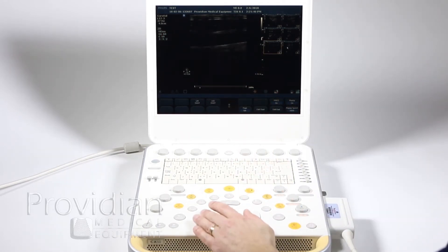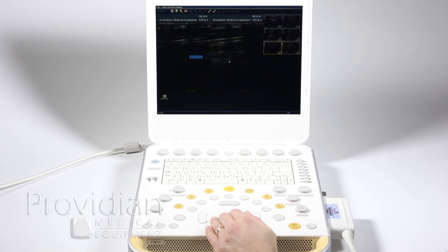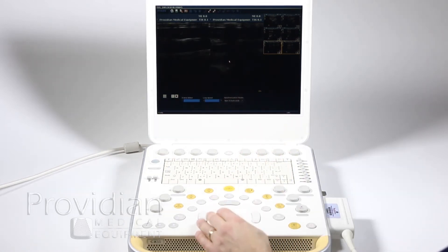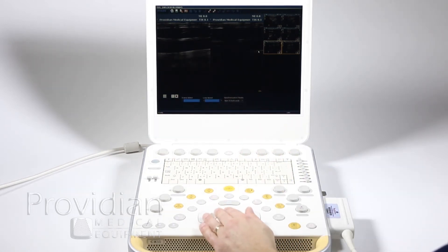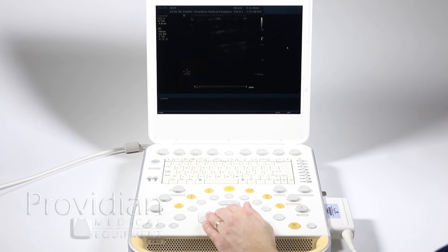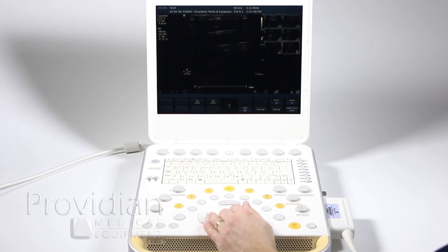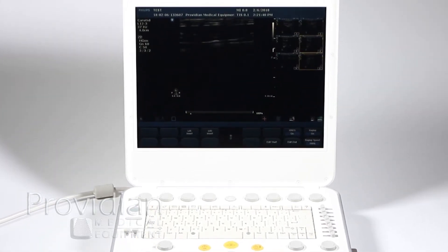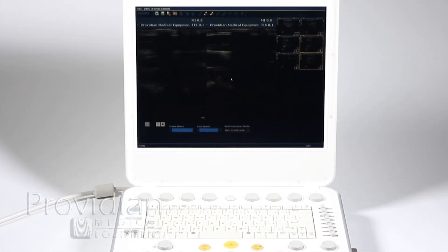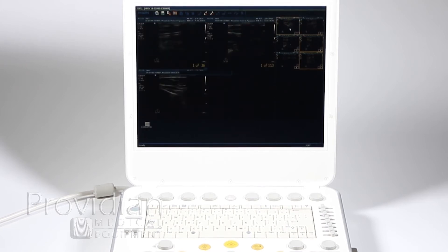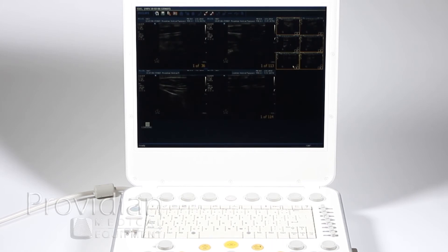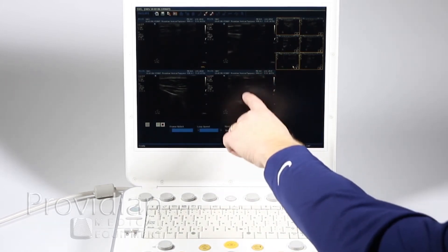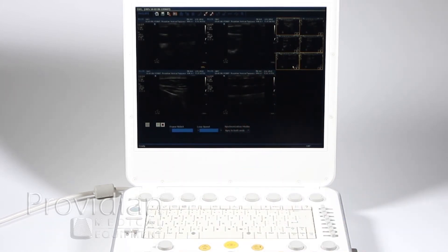If I select another one, it's going to give me side-by-side on those images. Then I can deselect that and it gives me the single image. You can compare multiple images there — this one showing 113 is how many frames you have. You have synchronization if you have your ECG attached.